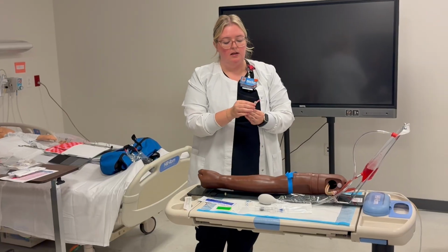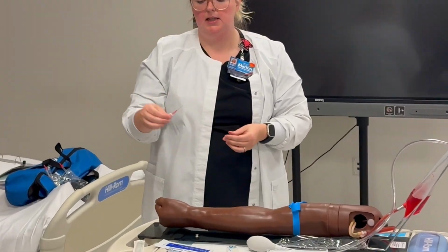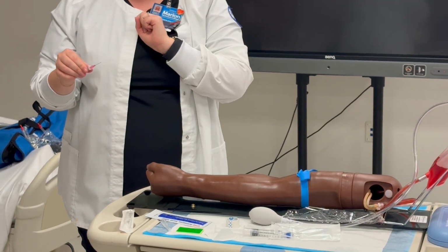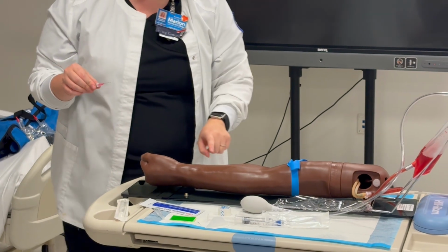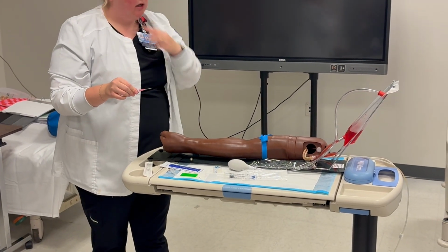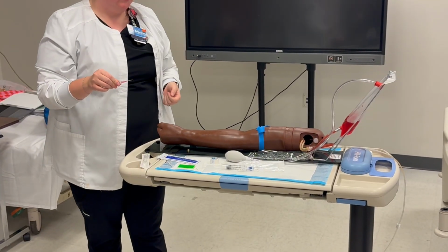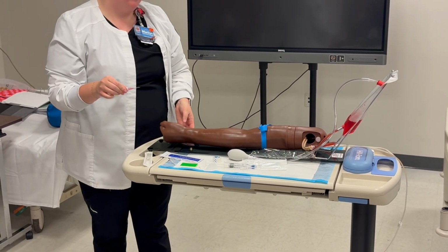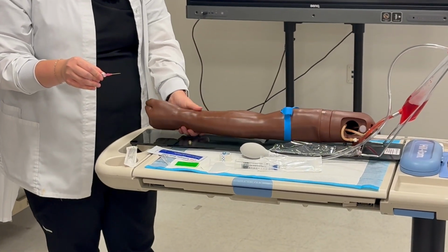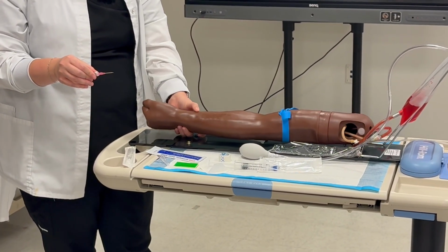All right, how I hold this is like this. See how this is like right here for your thumbs to go? Okay. All right. Can I touch this? No. No. Okay. So I picked where I'm going to go. You're going to go in at a 15 to 30 degree angle. I will not have a protractor or anything out to check this. And you want to pull the skin taut. I am right-handed, so I pull the skin taut with my thumb.